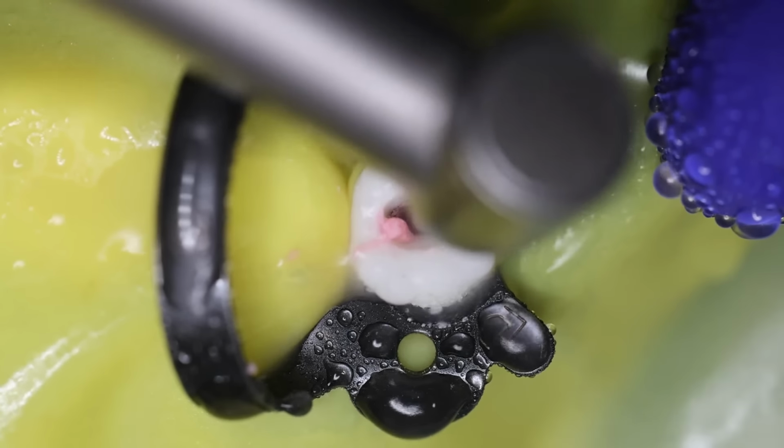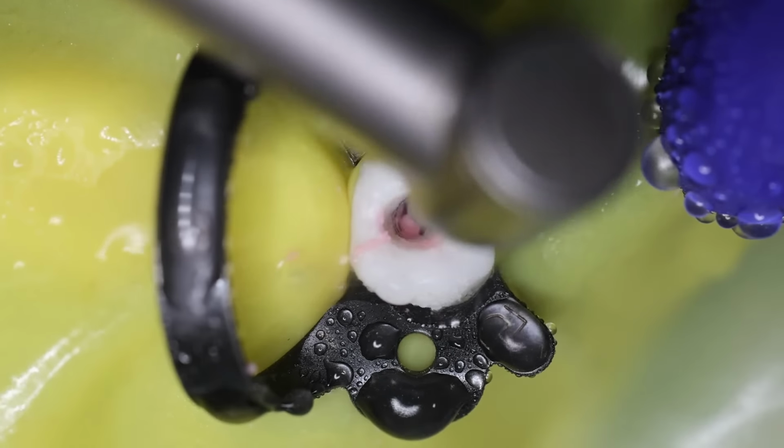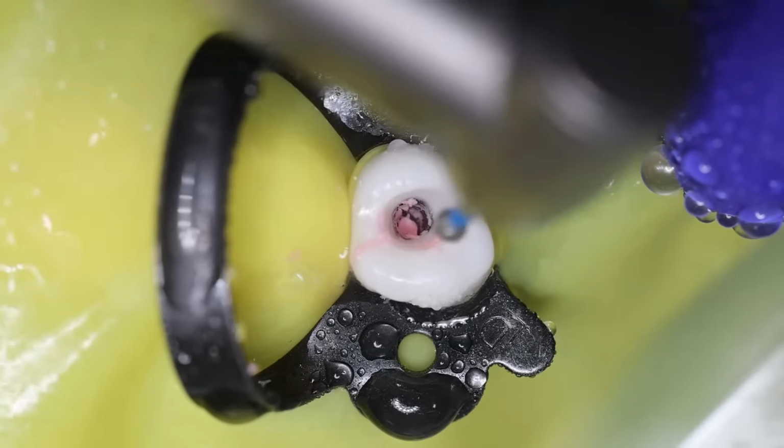The pulp tissue may start appearing, so don't worry, this is the coronal pulp tissue that you have to remove.